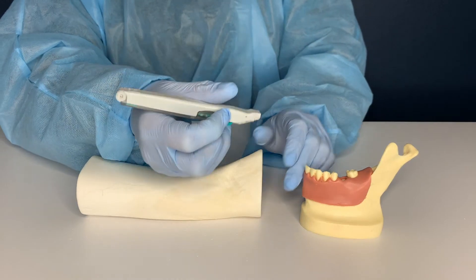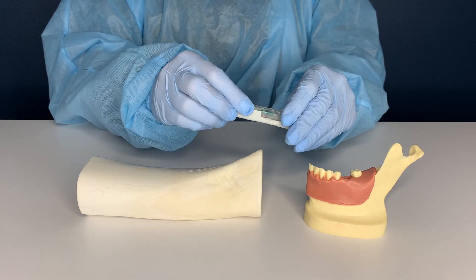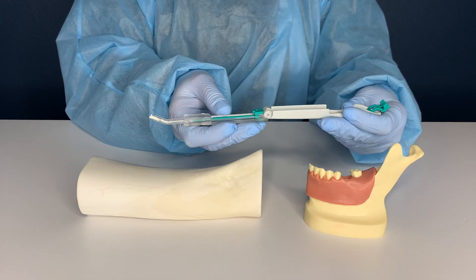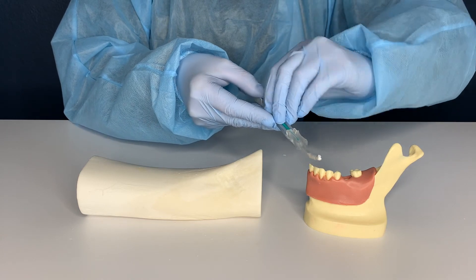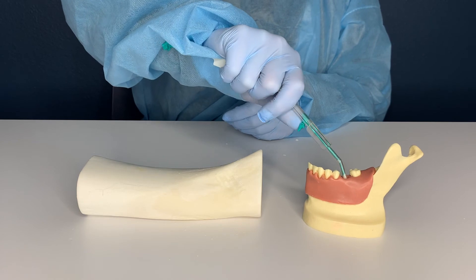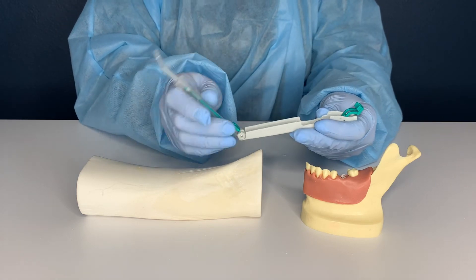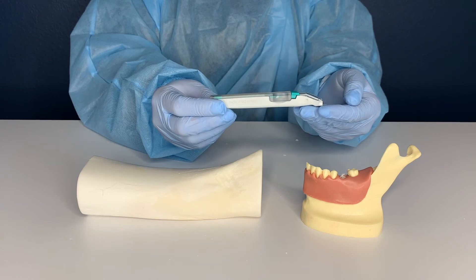To retrieve the bone, lift the green open tab above the cutting edge, separate the transparent and gray portions of the device, and use the green plunger to express the bone out of the syringe. Pull the green plunger back down into the original position, close the transparent and gray portions, and place the green open tab back down into the locked position. The device is now ready to be used again on the same patient.